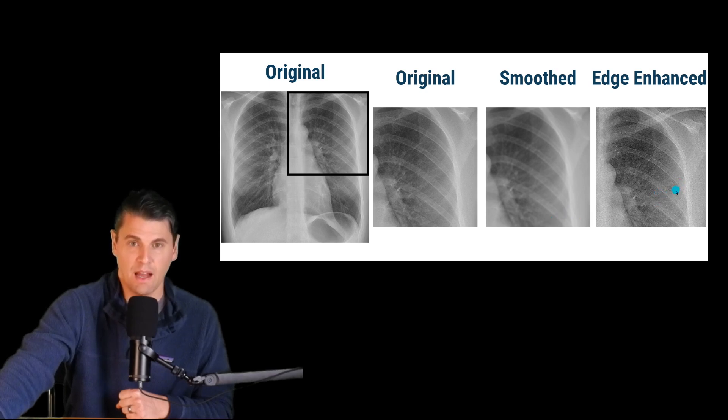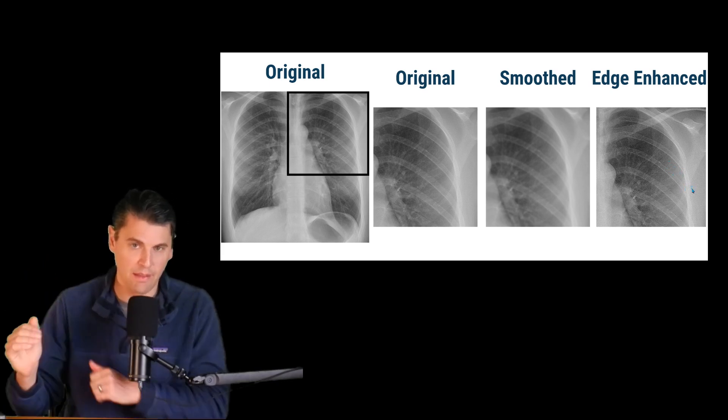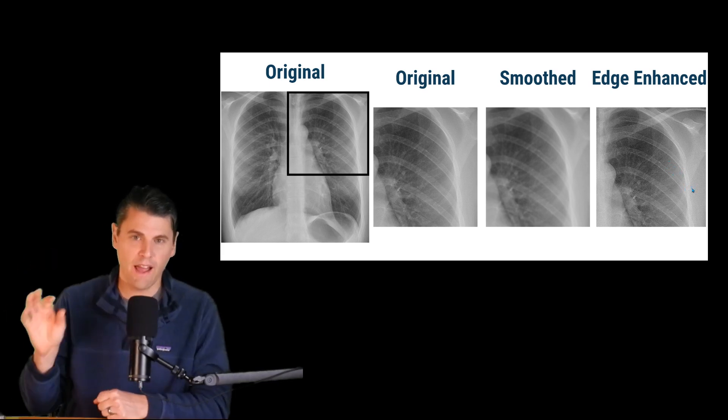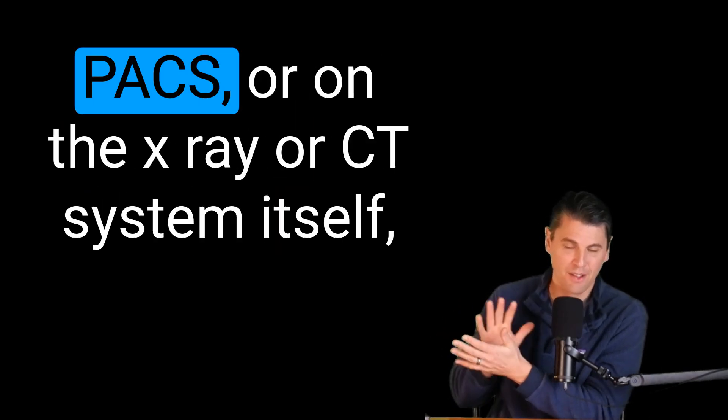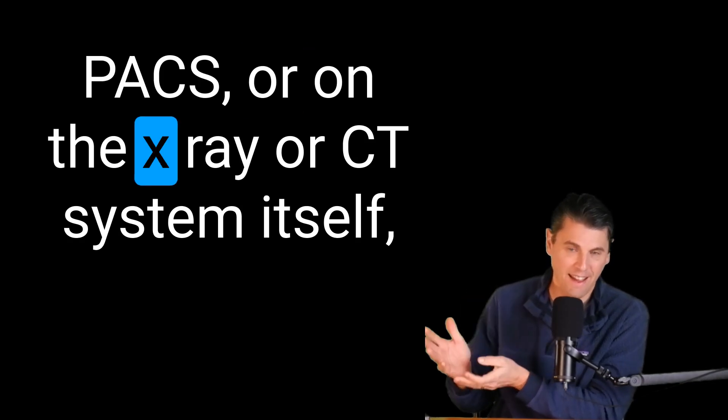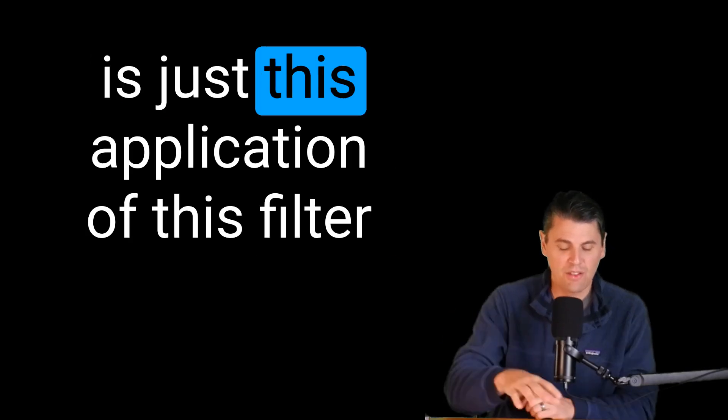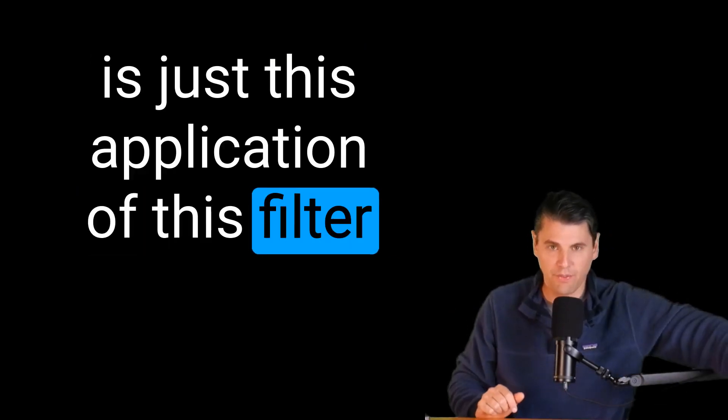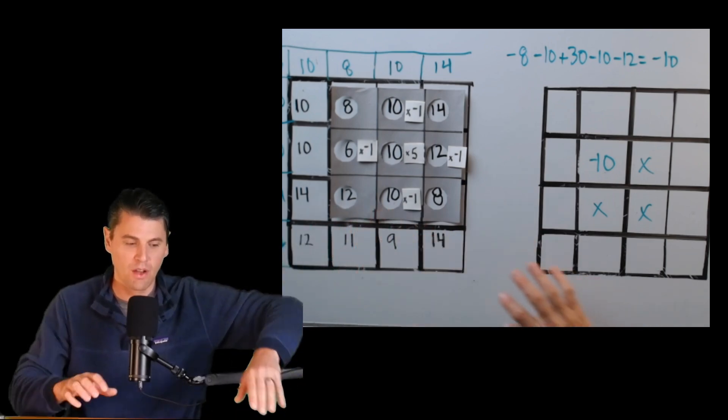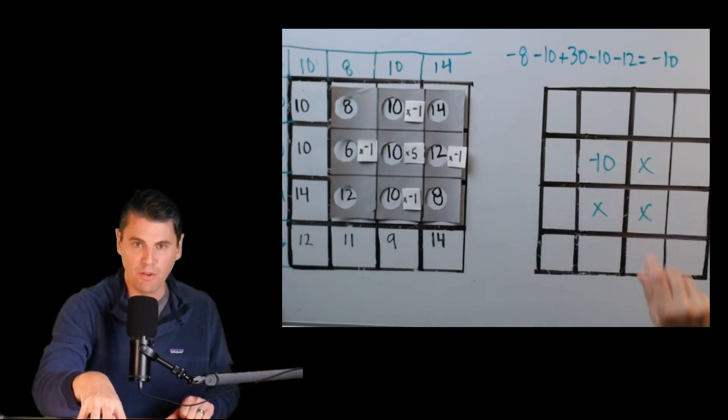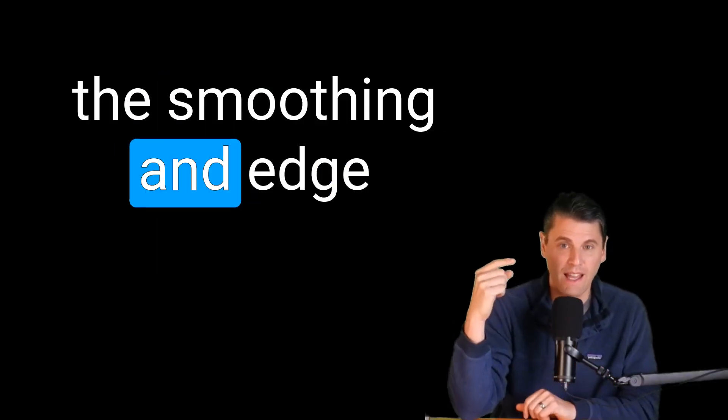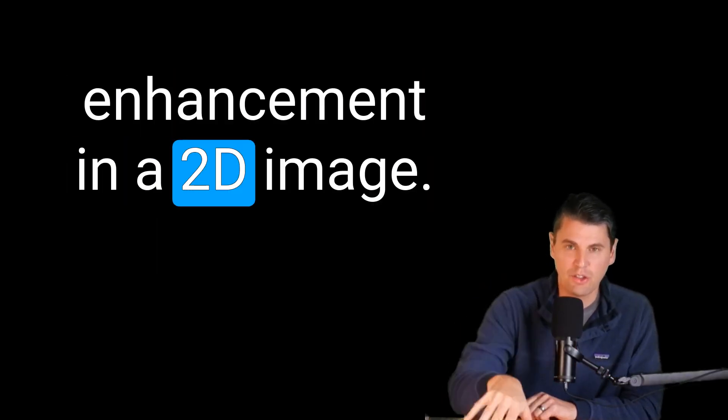And then the edge enhancement operation, on the other hand, is actually going to make the edges a little bit sharper here between, for instance, the rib and the background. All that's happening under the hood on the actual viewer or on the actual packs or on the x-ray or CT system itself is just this application of this filter where we're moving that filter across the image. We're applying those multiply and add operations, and then we're filling up our new matrix. Now you know all the details on the smoothing and edge enhancement in a 2D image.